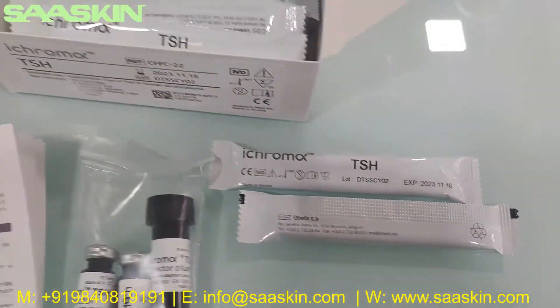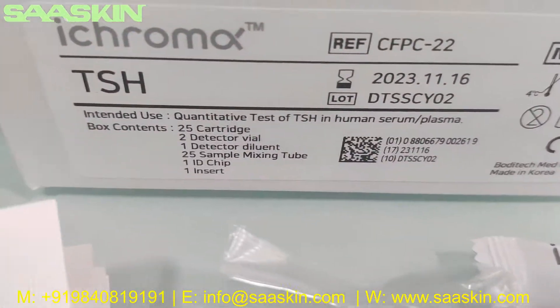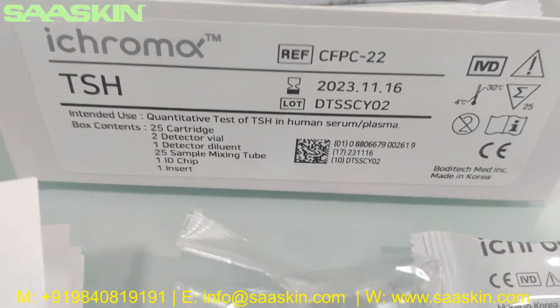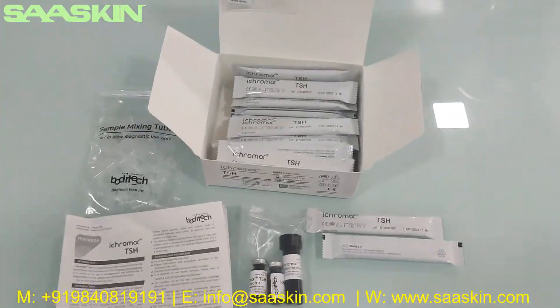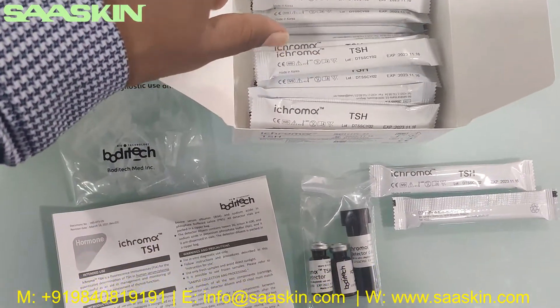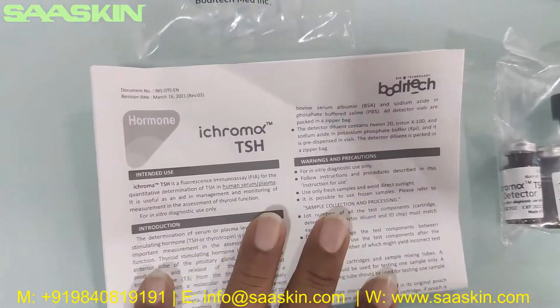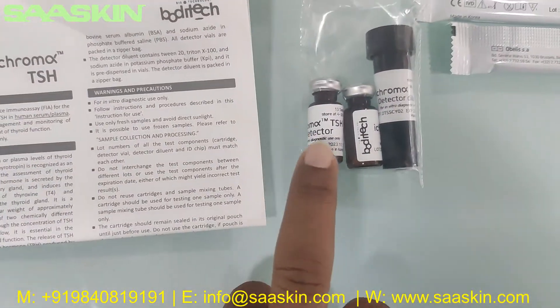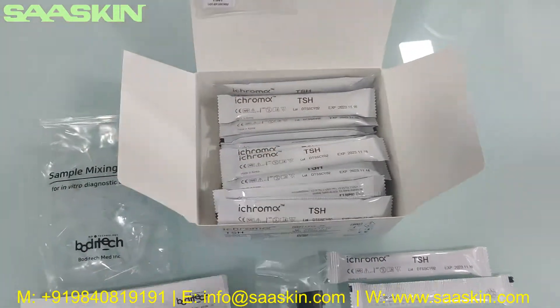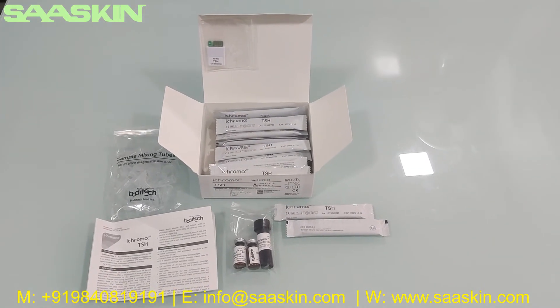To summarize, this is the Boditech iChroma TSH, for the quantitative test of TSH in human serum and plasma. Each kit contains one ID chip, 25 sample mixing tubes, one IFU brochure, two detector vials, one detector dilution buffer, and 25 test cartridges. This is the quick summary of the iChroma TSH test cartridge kit. Thank you.